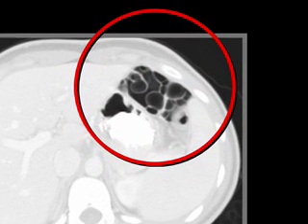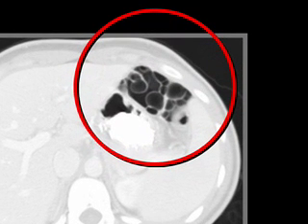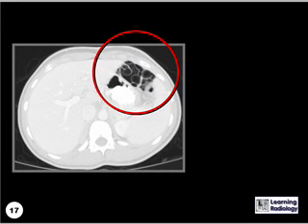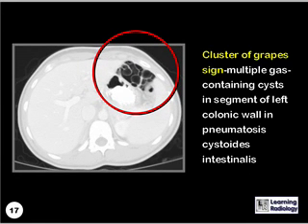What's the name of this sign? It's the cluster of grape sign, multiple gas-containing cysts, most frequently in a segment of left colonic wall in pneumatosis cystoides intestinalis.